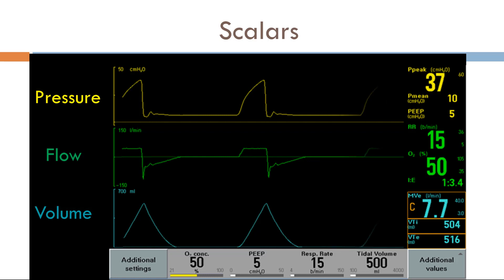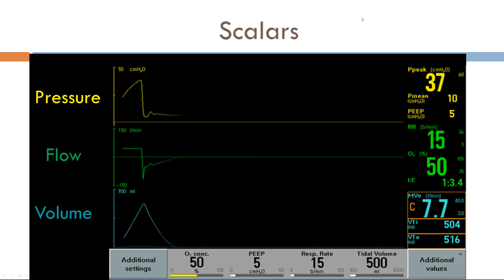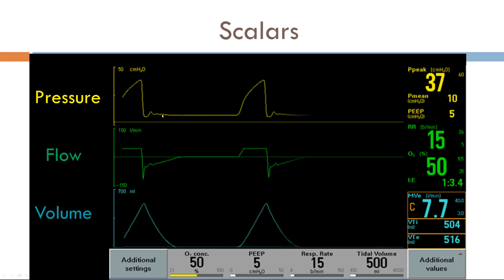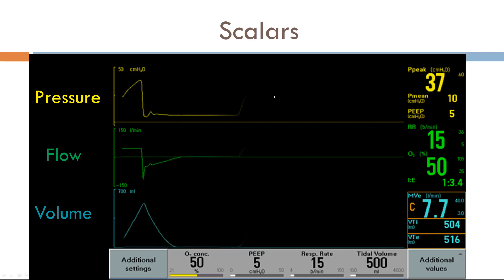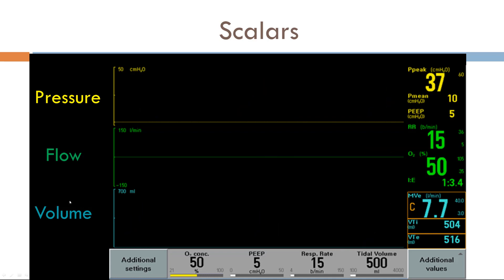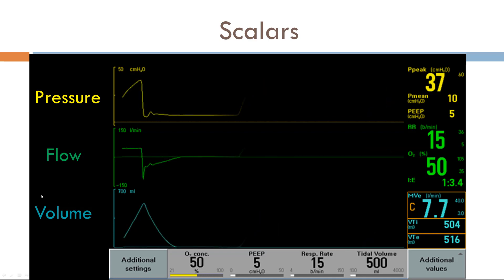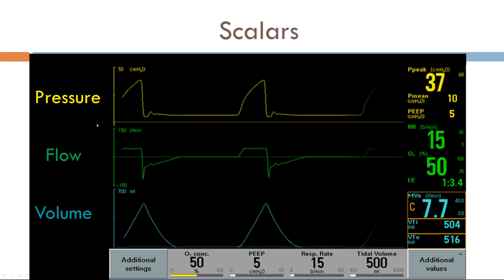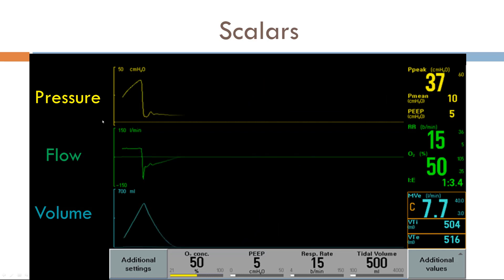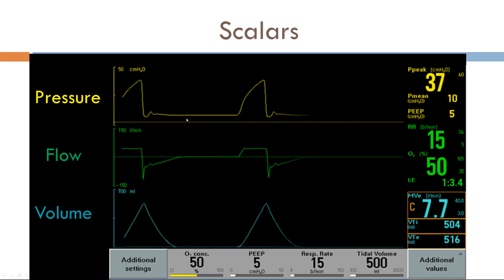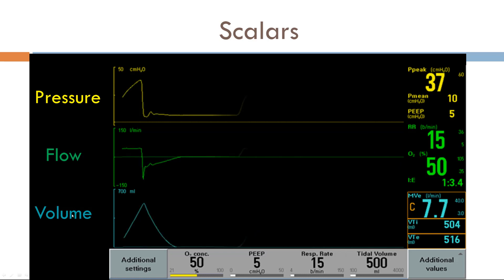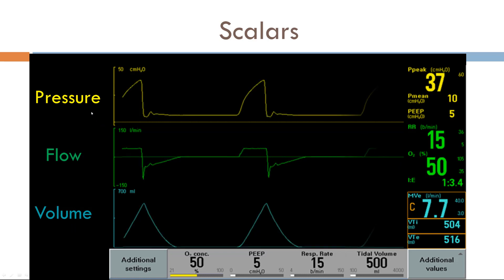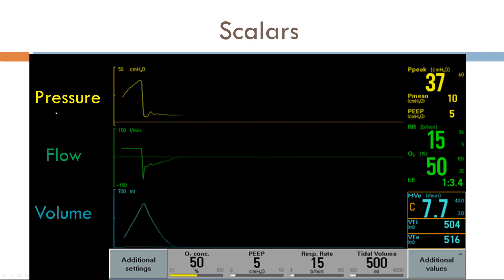When looking at a ventilator early on, people might get overwhelmed because as they see a single breath, they try to read up and down and interpret everything going on, but there's too much information. What I highly suggest is to read each scalar from left to right individually. Look at the pressure scalar and read it from left to right so you don't miss anything. Same goes for flow, same goes for volume. It's much better reading left to right compared to up and down.